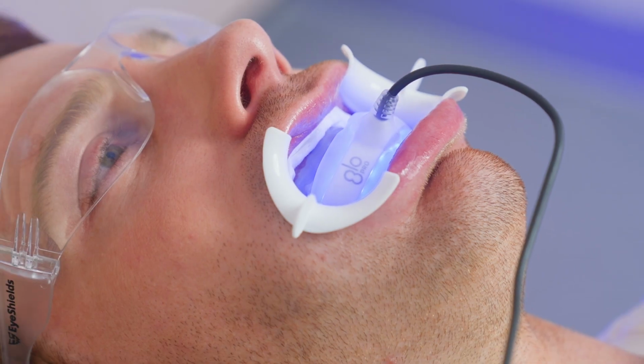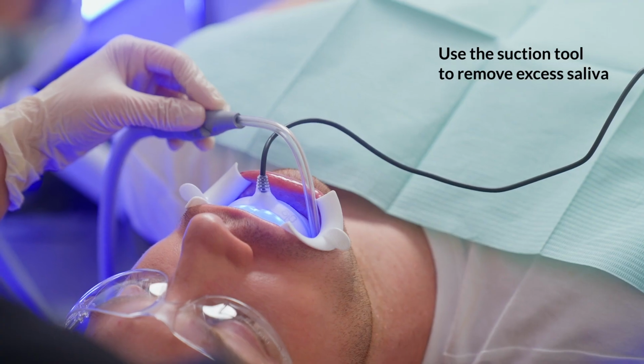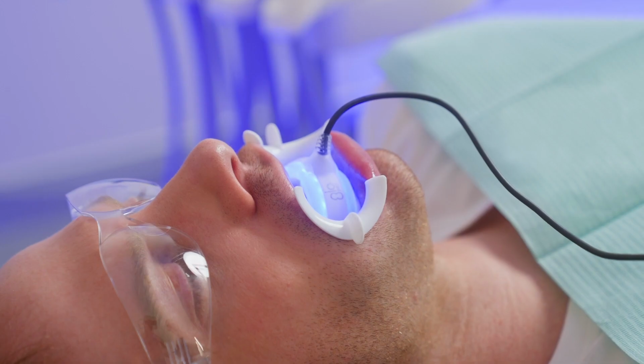The control and mouthpiece will light up. Ask the patient to gently bite down and, when needed, insert the small suction between the mouthpiece and the cheek. The GLO control will count down your 8-minute session, and it will blink and beep when the session is ending. The mouthpiece will turn off automatically.